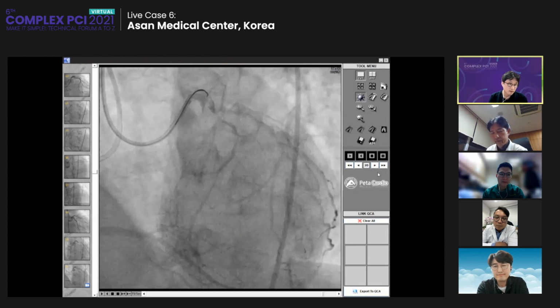We may not have the exact angio, but for the parallel technique, it is wise to use the second wire with a view in the maximal separated position for the angio and the first wire. But somehow they did not use that view.